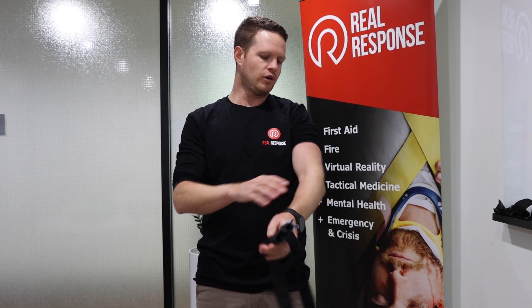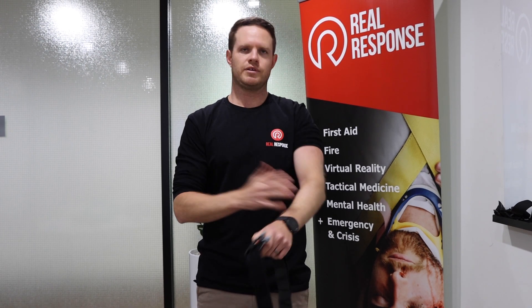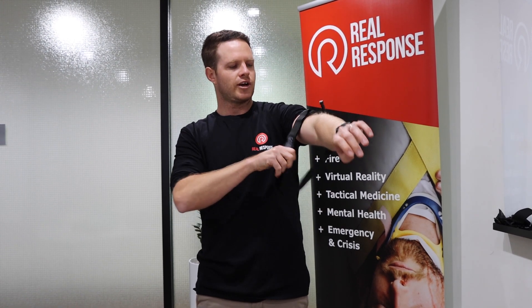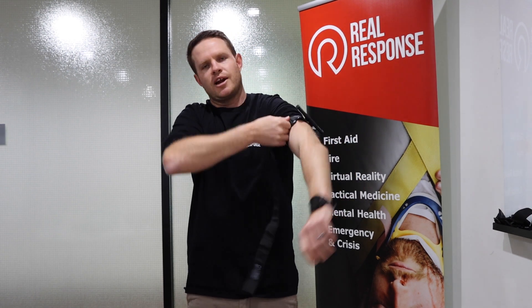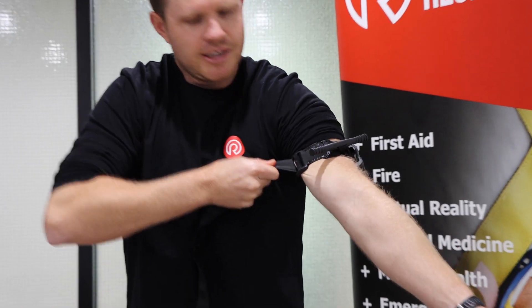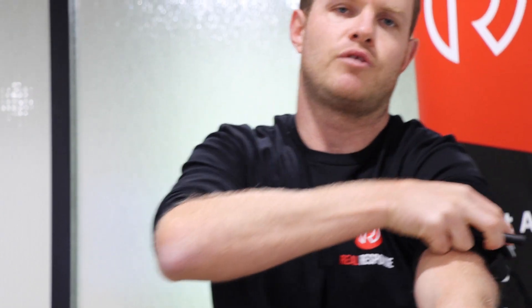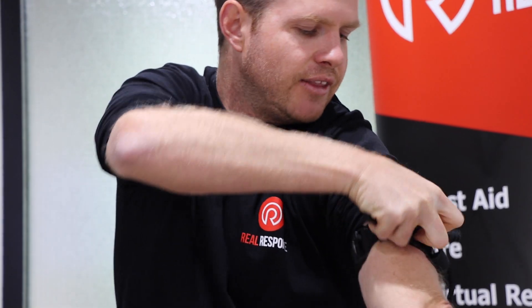In a controlled setting, two or three inches above the wound is your desired location. It can go on the lower limb wherever that bleed is. When you slide it on, the most important part is that we tighten that strap before we start to twist the windlass - pulling nice and tight. You should get an indent in the skin, which should only allow for one to two twists of the tourniquet.